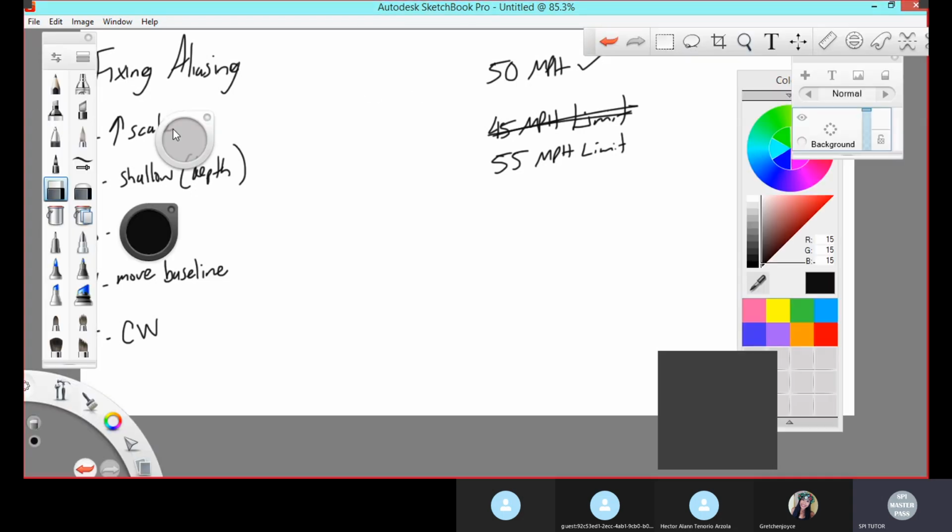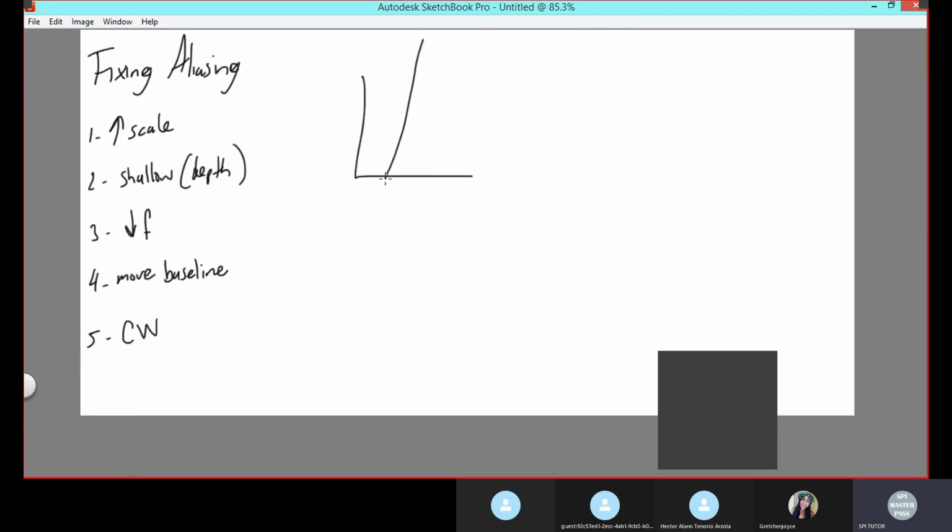Your scale says my wave is very big. My wave is too big. This is my glass ceiling right here. This is my limit. This is your scale right here. So these are all numbers, all velocities, and they have a limit right there. And because your wave is going over that limit, it breaks that glass ceiling. Now you have aliasing, and we'll get into like the shape of aliasing in chapter 20. But now you have aliasing, which is an artifact that you do not want.